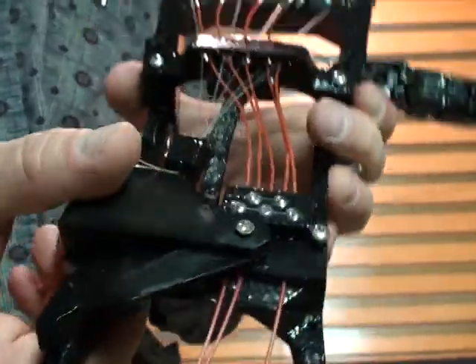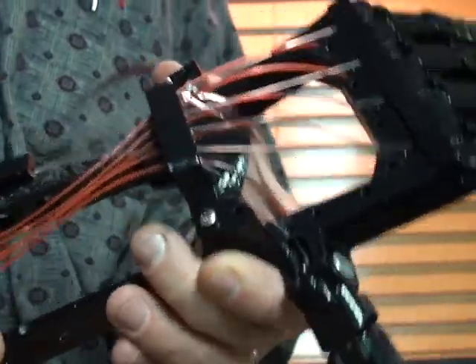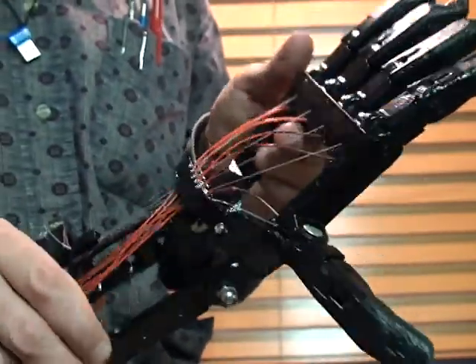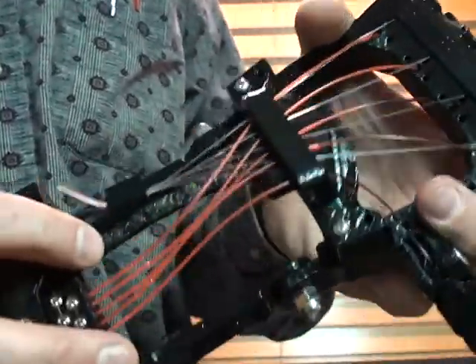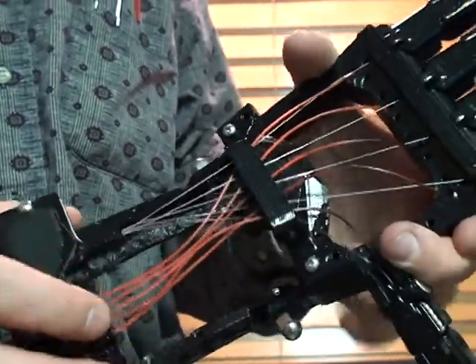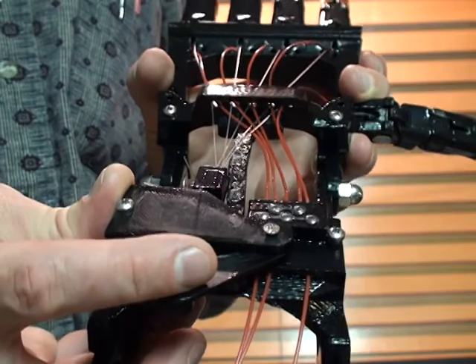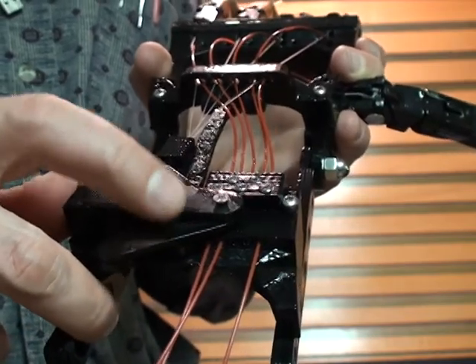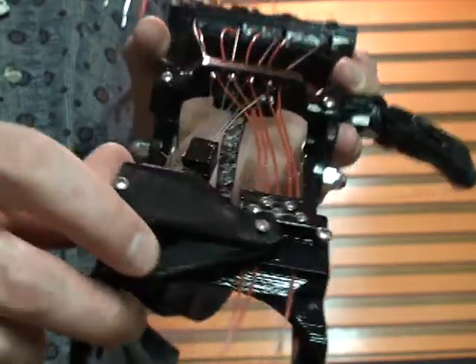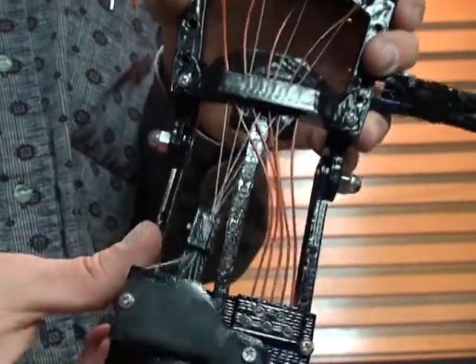It's not a problem. But the way that this works is the flexors work just the same as any other cable mech and hand. The extensor, though, you've got this rigid rod here that pushes back the middle part of the pivot. You can see the pivot sticking out here. Okay, so the pivot is anchored here right underneath this screw. The rod attaches or swings on the pivot in the middle, and on the end of the pivot here is where this extensor anchor is attached.